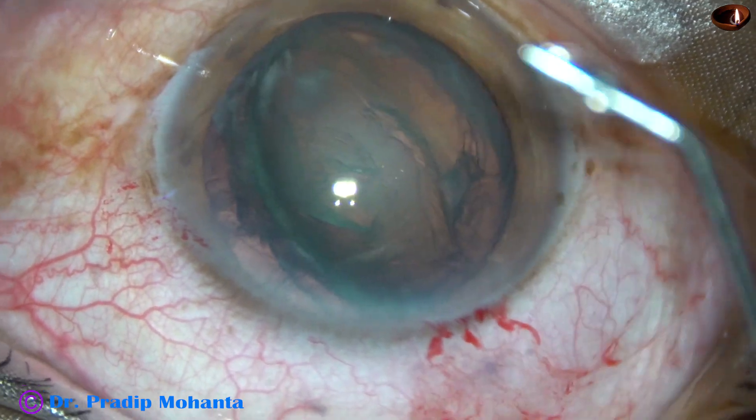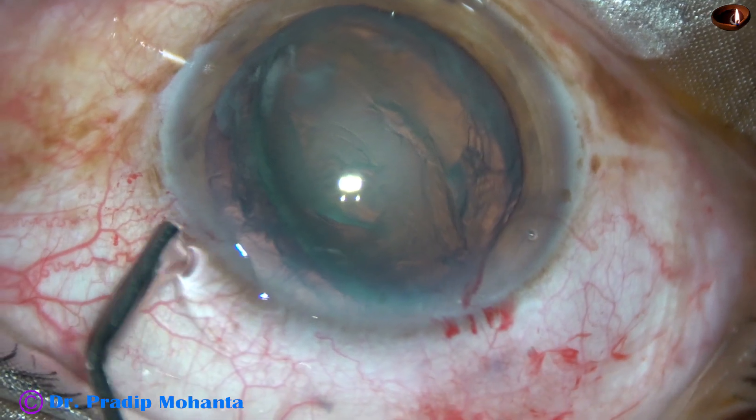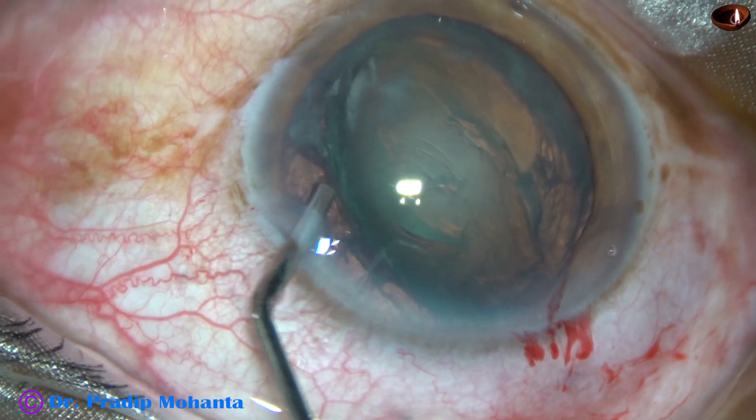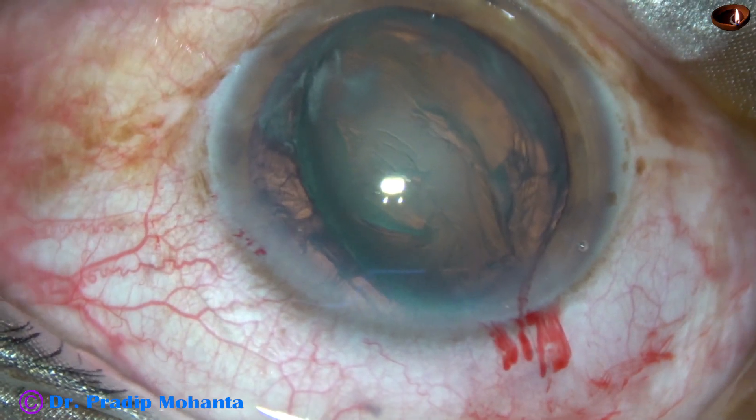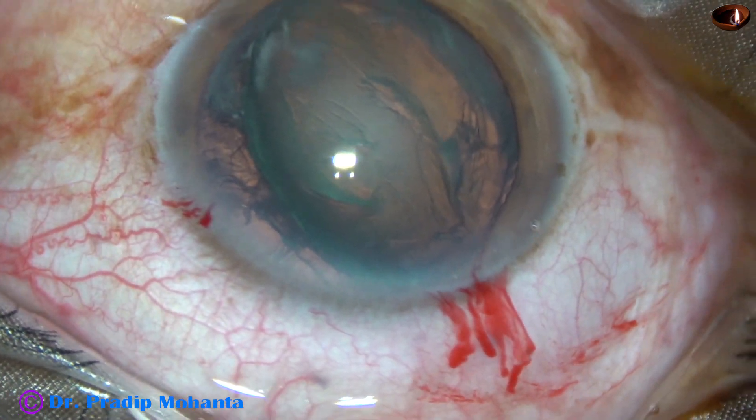Now, visco is injected on both sides. And now it is time to introduce the tip of the phaco needle.